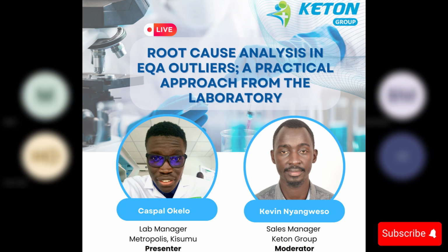On your question of after how long, this mostly depends on the process and test frequency. The general guidance that I always give is that you have three stages or intervals. You have to do a short-term check, within 1 to 4 weeks after implementation, you check for stability of your QC.